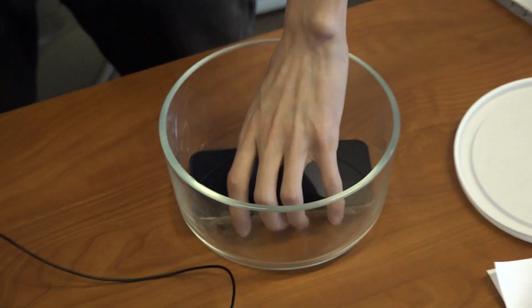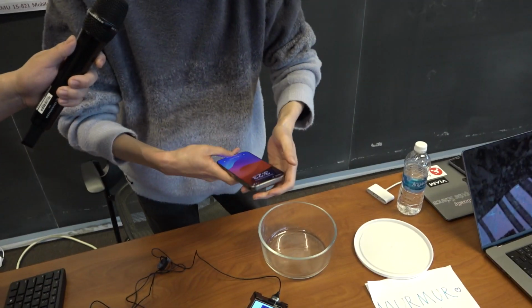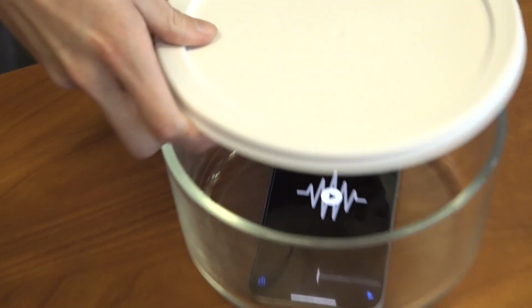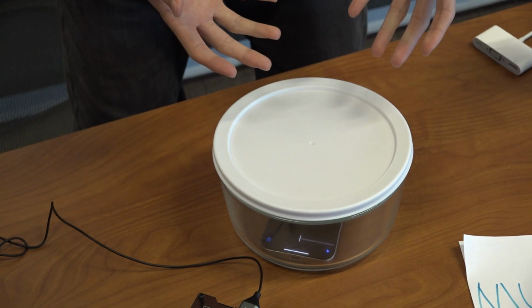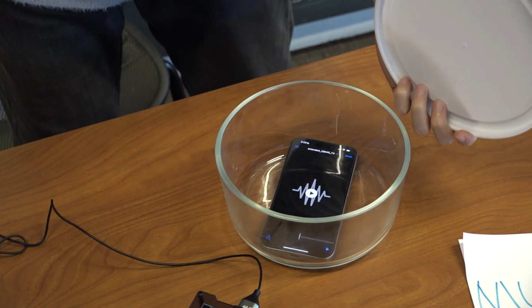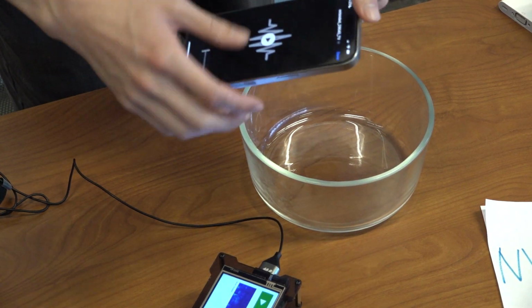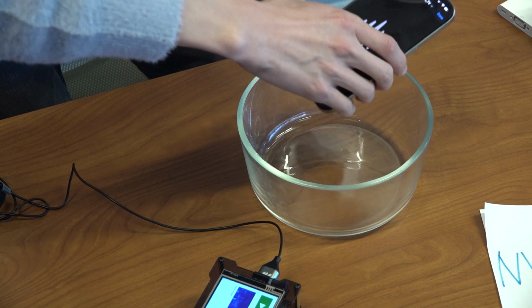So for the second part, we are using a recording from a real murmur patient, because most people actually don't have a murmur. We use this, which we call a chest phantom. It's quite simple, but we use this to simulate the heartbeat from a real person, and we play the murmur recording from a real patient, and we use our algorithm to detect the heart murmur.